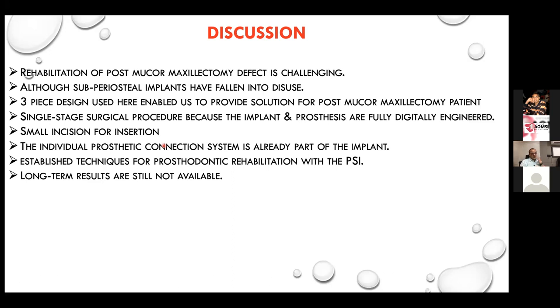There was actually no surgical complication. I mean, one patient had an infection, which was taken care of just with irrigation and debridement. One patient had a broken screw in the prosthetic. All the complications were managed chairside because the implant was already fixed. We are still waiting for the 1 year result, where I can take a CT scan of this patient and compare the bone resorption underside of the plate which has been given.